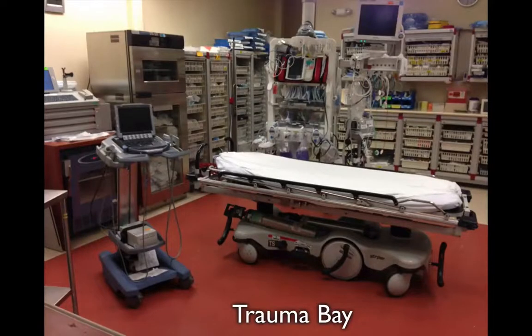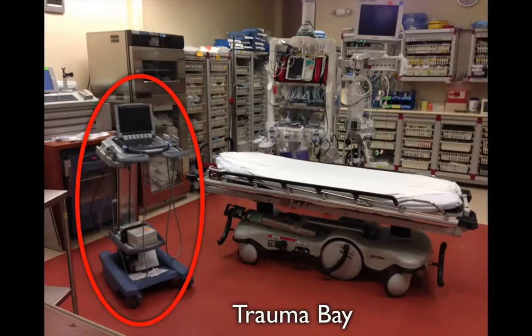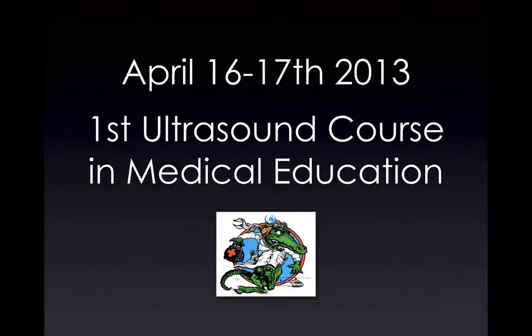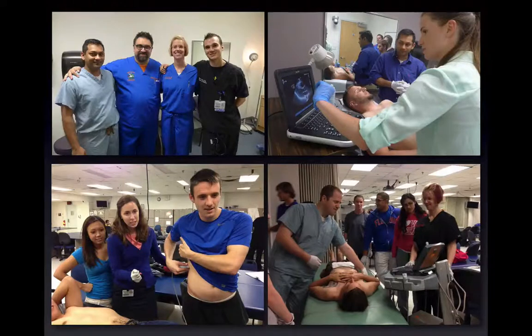But in the trauma bay, obviously, we have ultrasound machines because we use them all the time. This is one during a trauma code, a trauma alert. Everybody's suited up for action there, and you can see on the left portion of your screen the ultrasound machine. And this all started here in 2013 when we had our first ultrasound course.